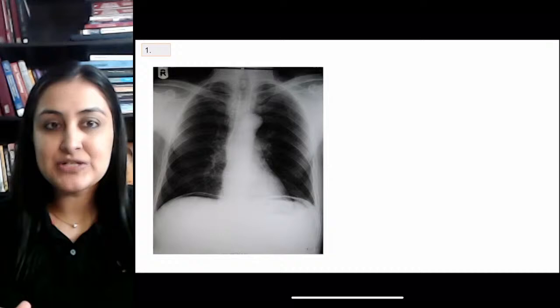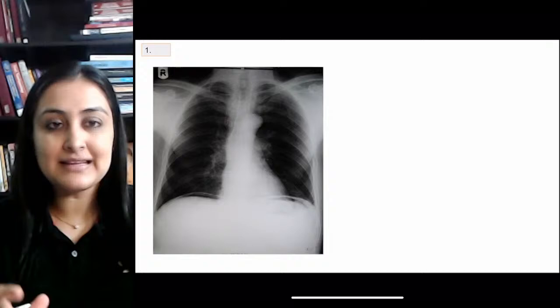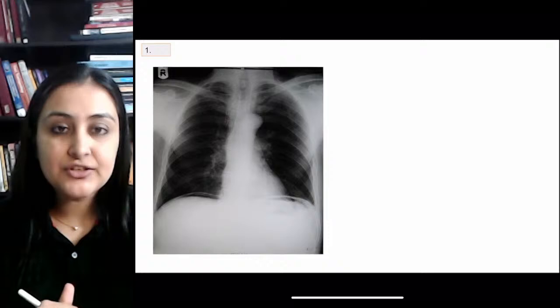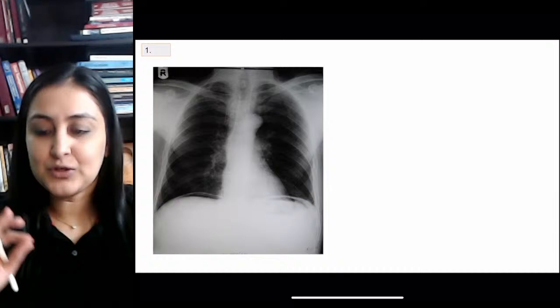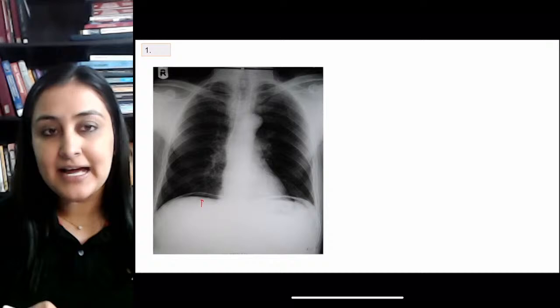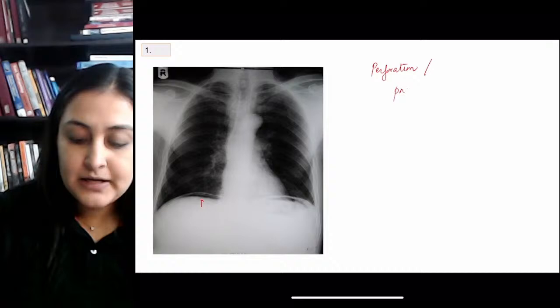Starting with the first most important image — extremely important in every exam. History: severe pain abdomen with guarding and rigidity. Anytime abdominal symptoms are given but a chest X-ray is shown, there is only one possible diagnosis. Your eye should go directly under the right diaphragm. If you see black air under the right diaphragm, the diagnosis is pneumoperitoneum — perforation of a hollow viscus.